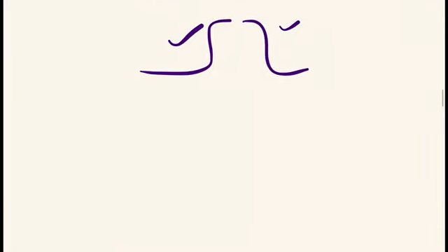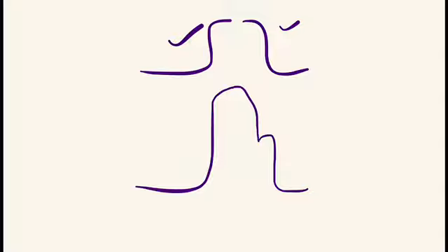Now suppose there is any change, any hypertrophy of the right atrium, that will increase the height of the first part of the P wave. So it will look like this, but as there is no hypertrophy of the left atrium, it will look like this. Now if we connect this, this will be the ECG if there is right atrial hypertrophy.